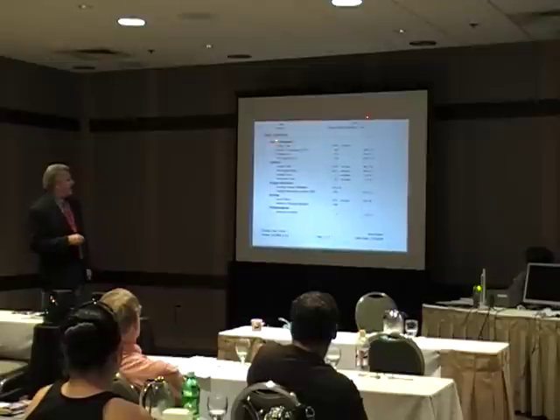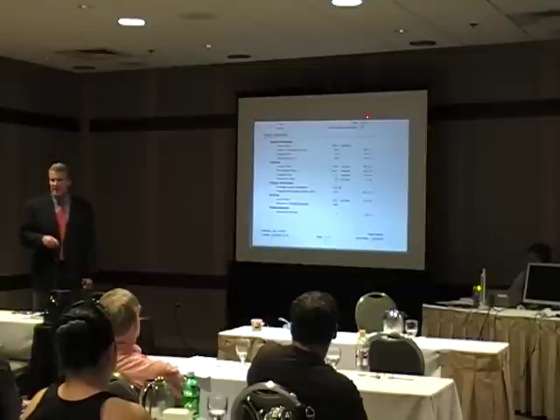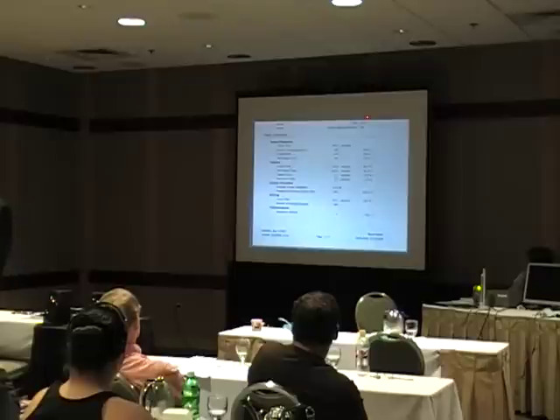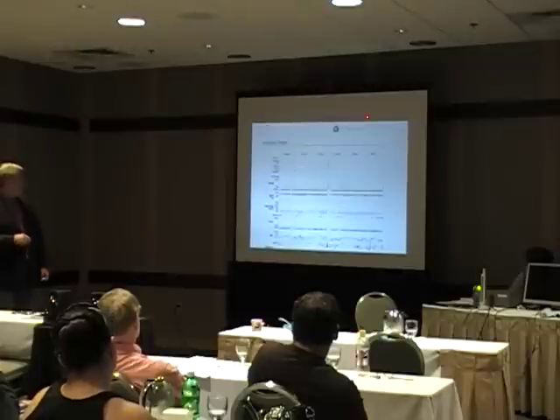Okay. And apneas, hypopneas. Okay, we have 359.5 minutes of data, 80.5, 81.6 on his back, so his AHI based on a take home is about 80, 81, right? Okay. Oxygen saturation, his average is 92, and he had 91 desaturation events per hour. Okay. Snored 11%, 10.9% of the time, okay? Further on his report, here's the raw data.